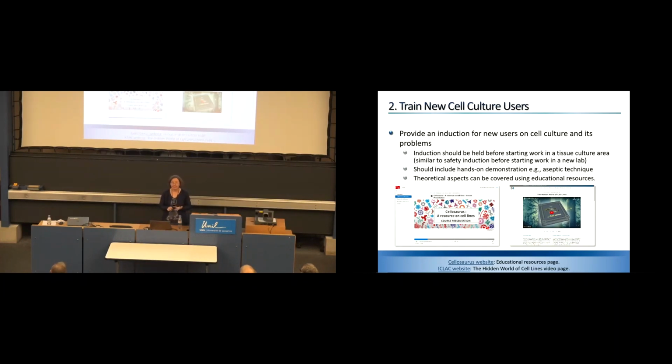Okay, so that's test. The second is train. So anybody who trains new users to their tissue culture lab, I salute you, and you're doing a fantastic job, because this is essential. We've always got new people coming into this field, and people don't know unless they're taught. So the teaching, of course, teaching aseptic technique is really important, but it's also important to teach the theory, this sort of problem. And it's important to be aware that there are more educational resources in this area compared to a few years ago. So a couple of screen captures there.